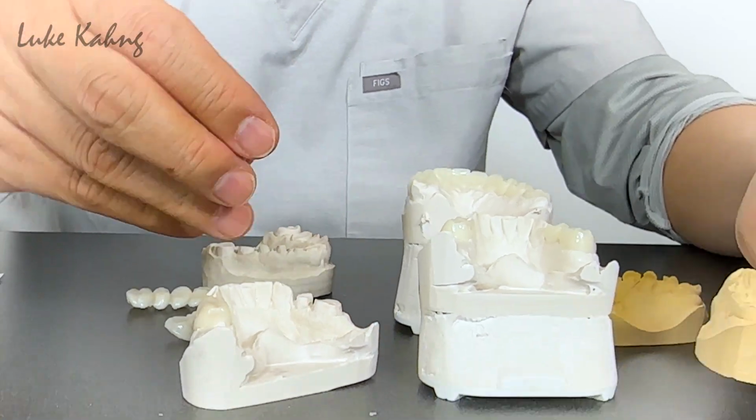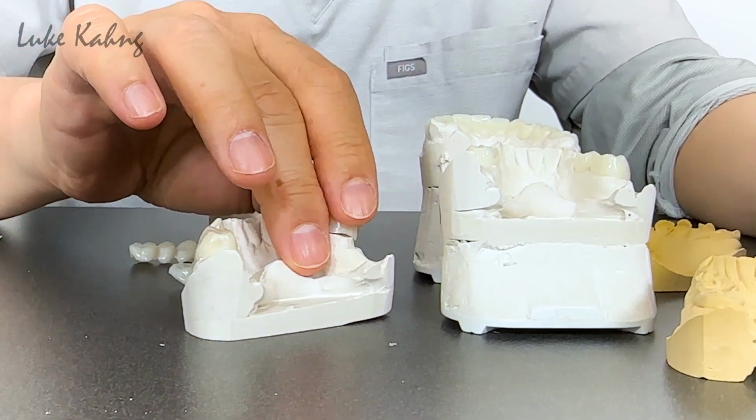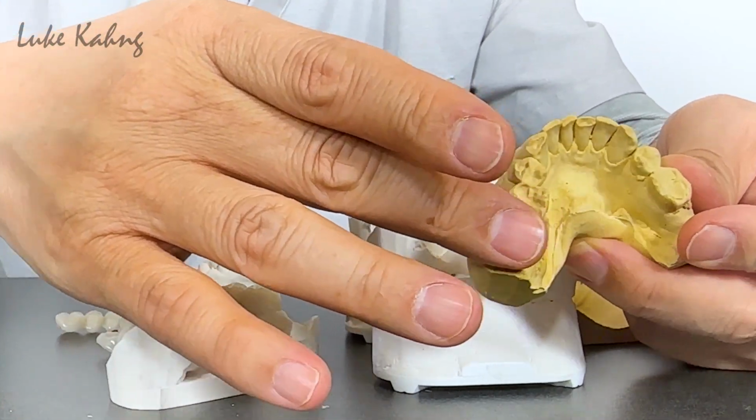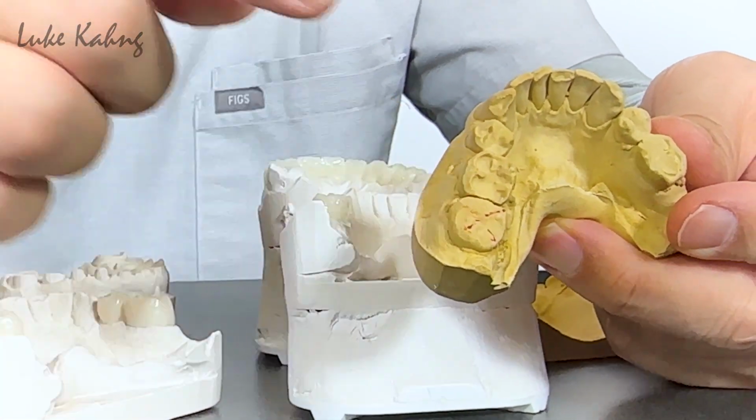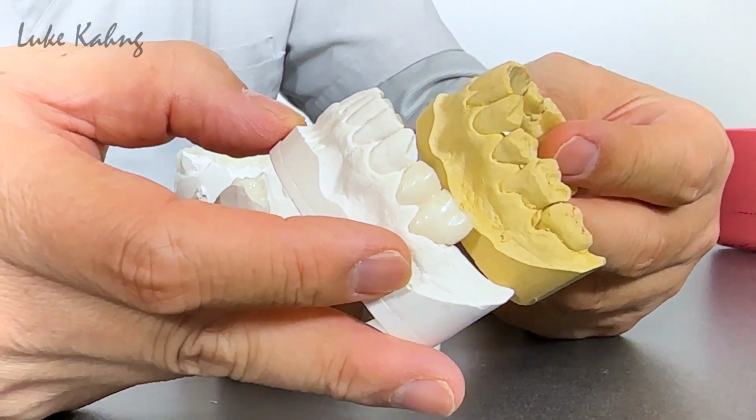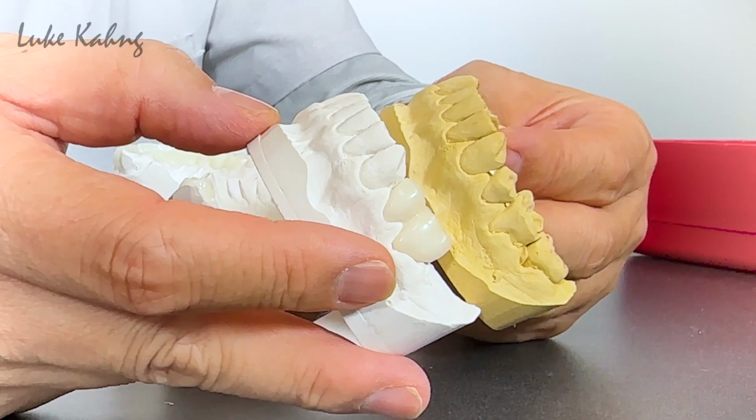after we prep it. We're considering the restorations between the teeth. So the doctor said this one is to be removed, so we did it, and then we built it, and then posterior we built it. Okay, especially occlusion.